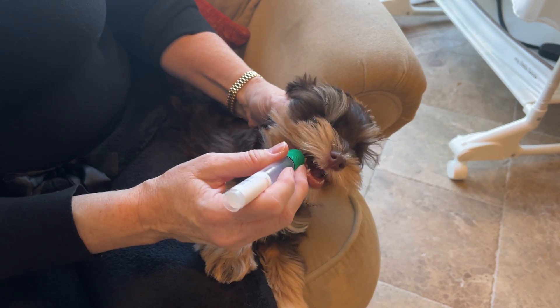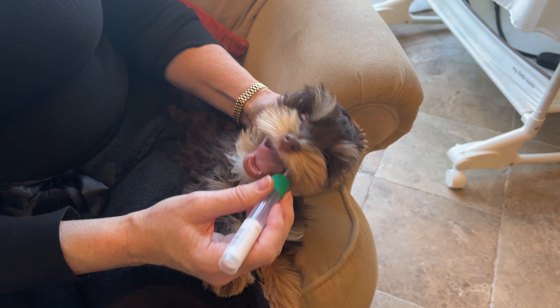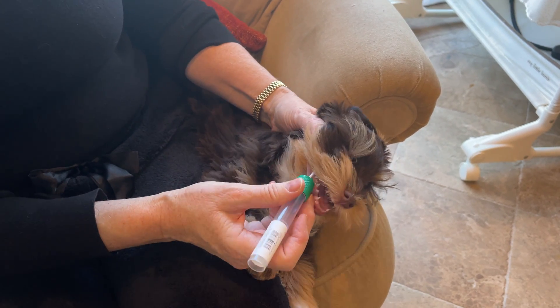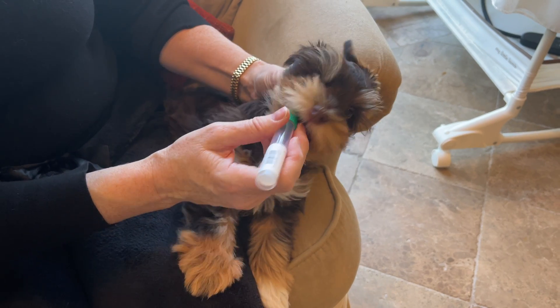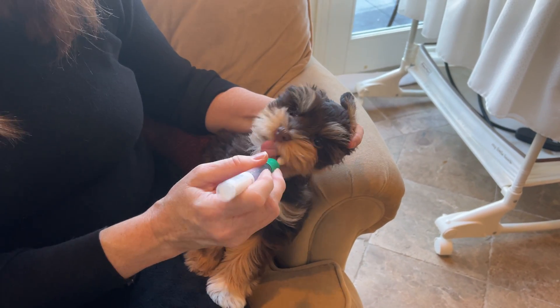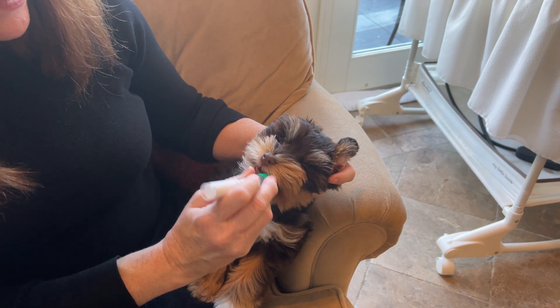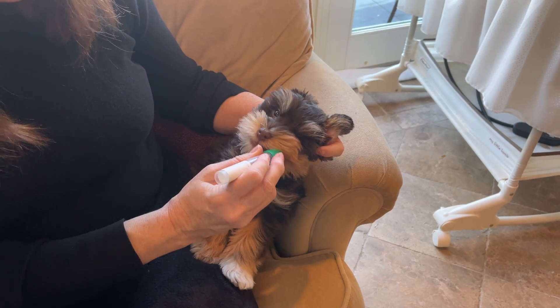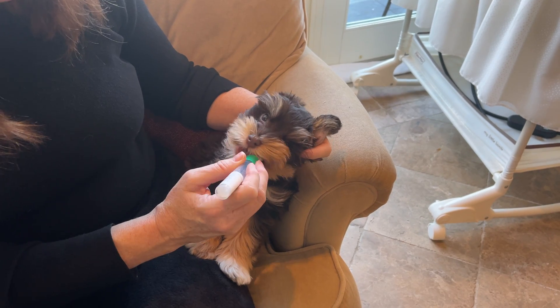I've also heard some breeders tell stories of dogs that literally chewed the thing off, and they put it in, sent it in, and got the dog's results back. I find all of this amazing — what science can do. Truffles is being a good sport here. I like to make sure I've gotten plenty of saliva on there.